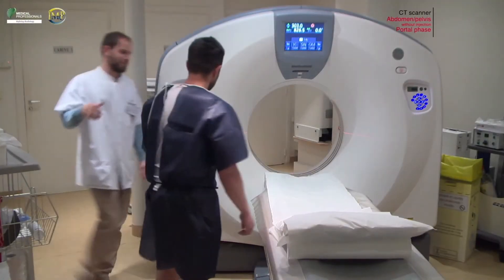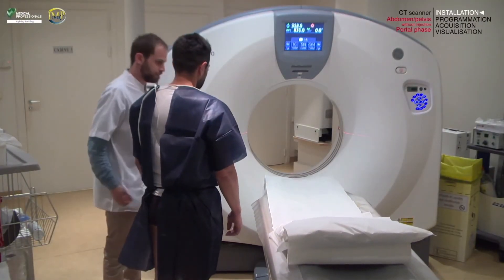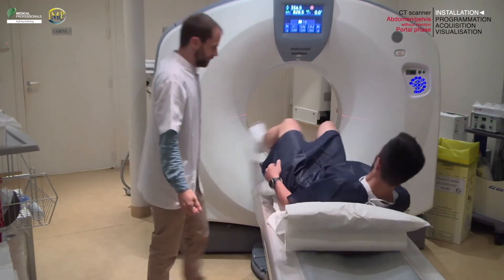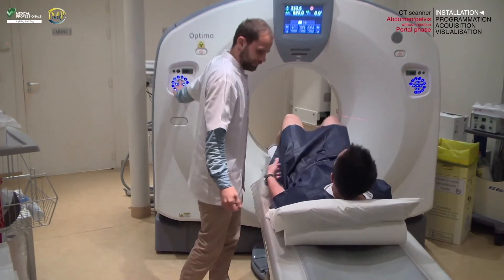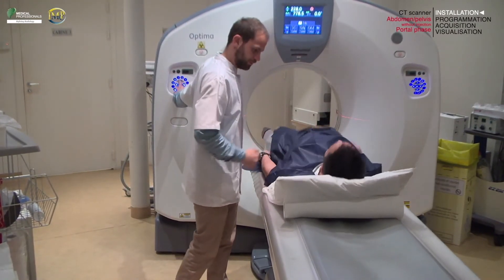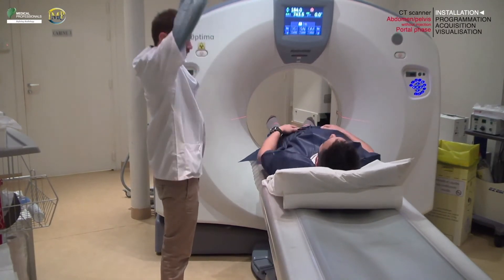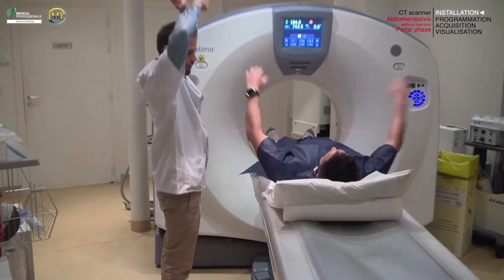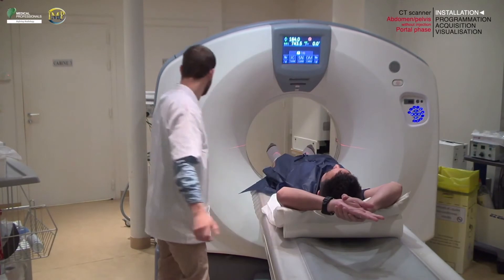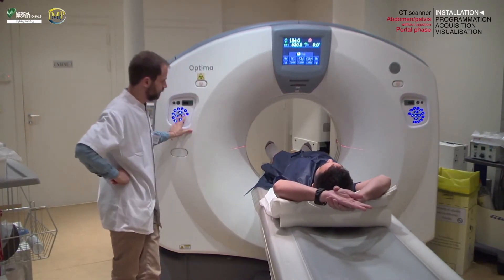After verifying the patient's identity using at least two identifiers such as first name, last name, and date of birth, place your patient in a supine position with their arms above the head. For the patient's comfort, place a pillow or an incline plane under the patient's head.